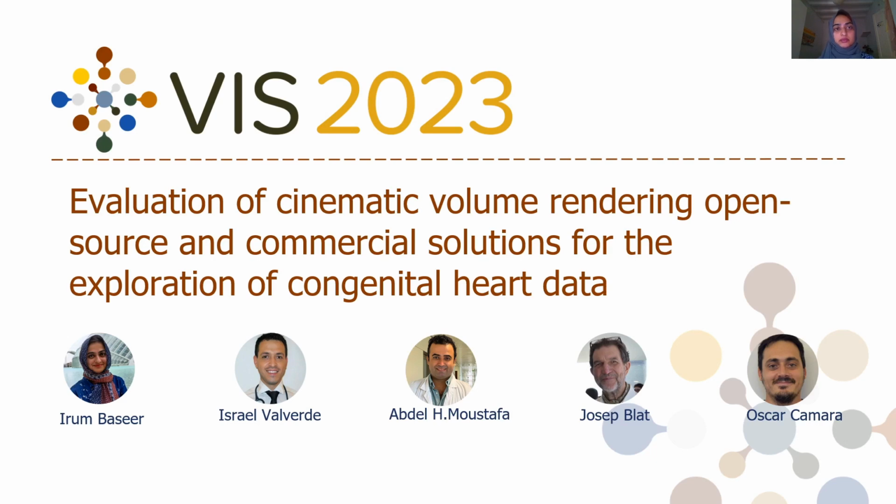Hello everyone, I am Irum and today I will talk about our work, evaluation of cinematic volume rendering open source and commercial solutions for the exploration of congenital heart data. This work was done with the collaboration of Israel Valverde and Abdel Moustafa.